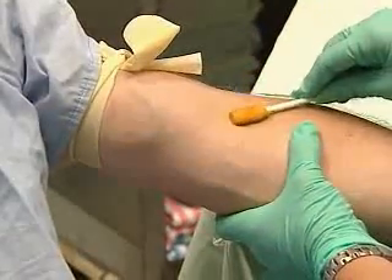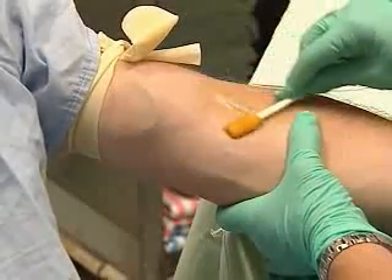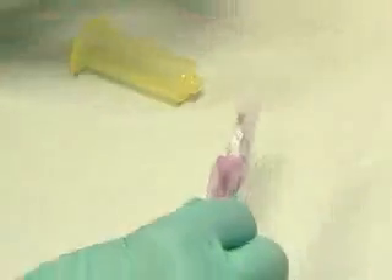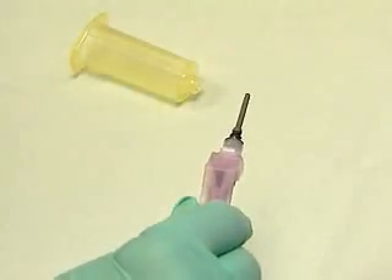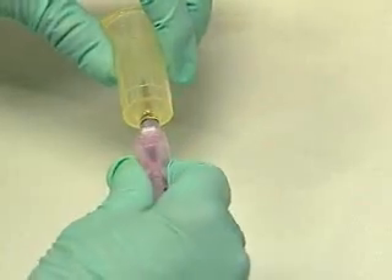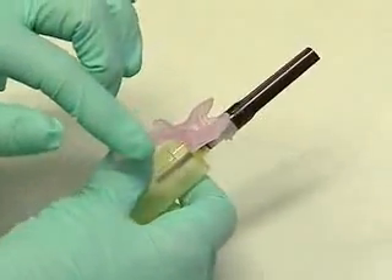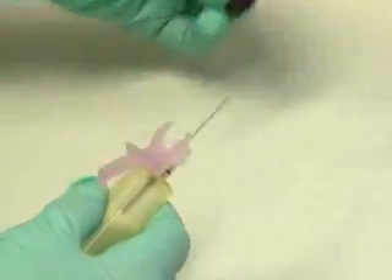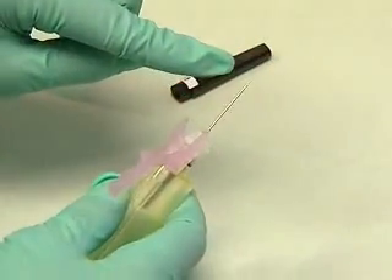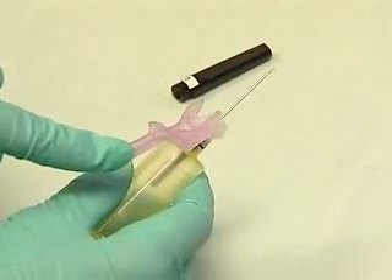The universal precautions for this procedure begin with gloves and careful cleansing of the skin with alcohol or betadine. Carefully remove the cap to unsheathe the needle. Insert it into the yellow vacutainer and screw it into place. Then lift the needle guard and remove the cap. You'll see that the hole in the beveled edge of the needle is facing up and is in line with the needle guard.